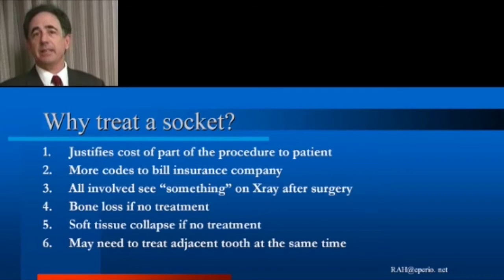No treatment, again, leads to soft tissue collapse and the possibility of an unesthetic result, either with a fixed bridge pontic or a dental implant supported restoration.